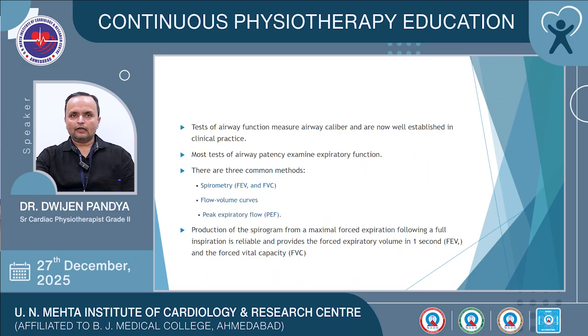Tests of airway function measure airway caliber and are now well established in clinical practice. Most tests of airway patency examine expiratory function. There are three common methods: the spirometry, which measures the FEV1, that is the forced expiratory volume in 1 second, and FVC, that is the forced vital capacity, the flow volume curve, and the peak expiratory flow. Production of a spirogram from a maximal forced expiration following a full inspiration is reliable and provides the forced expiratory volume in 1 second and the forced vital capacity.